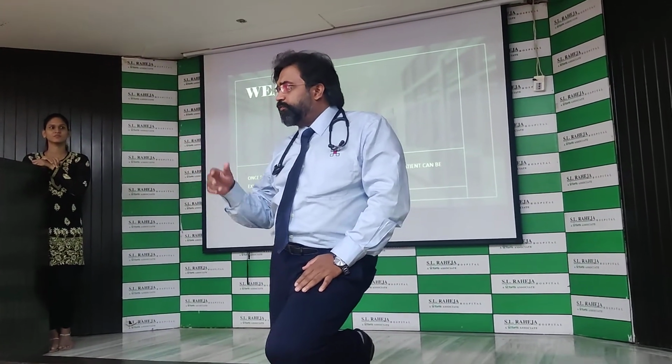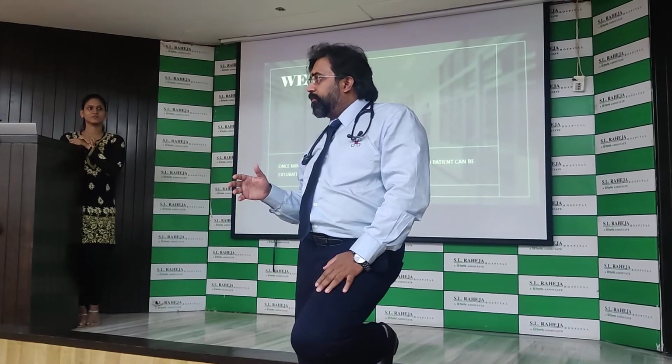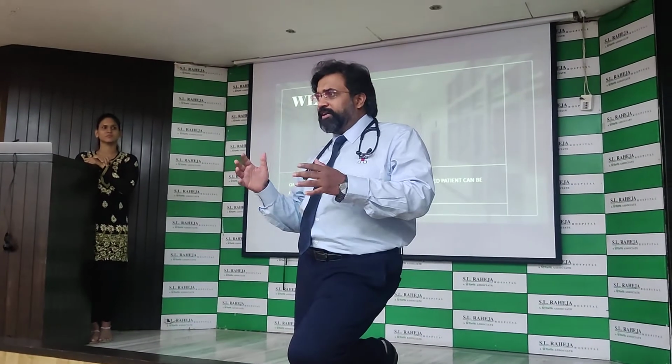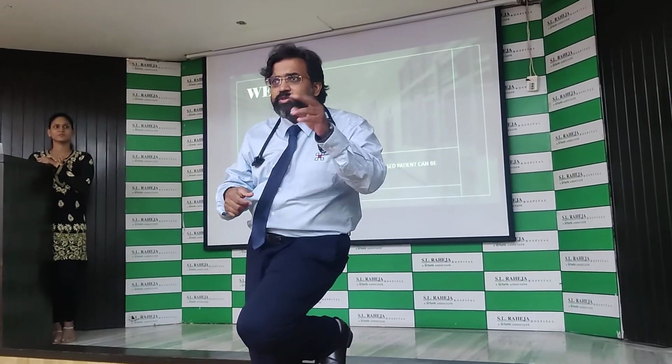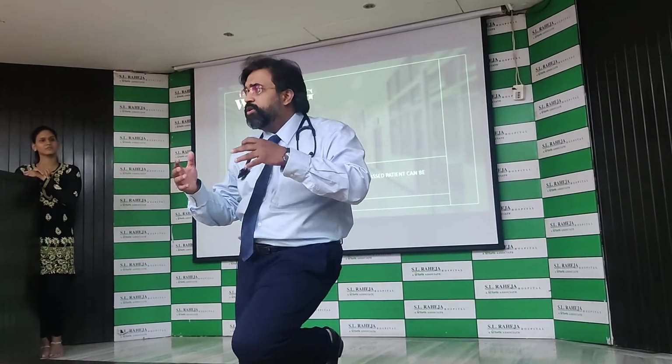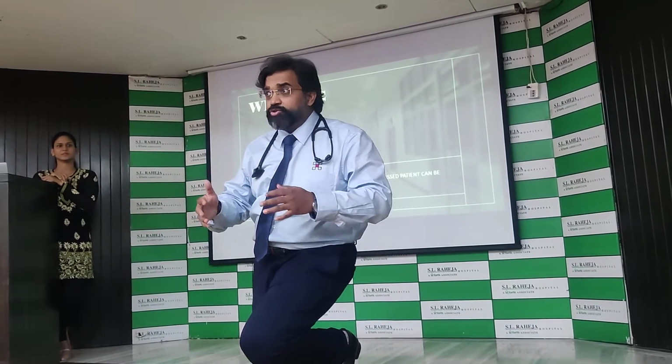Now 3 days have passed, 4 days have passed. His whole process is getting better and better. He starts breathing on his own also. You don't have to change the ventilator from this to pressure support. You don't have auto trigger. You don't have all those things. Asynchrony comes down because you don't have to do anything.